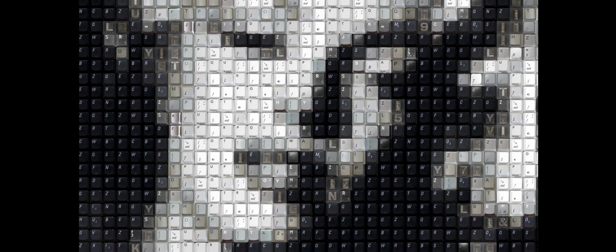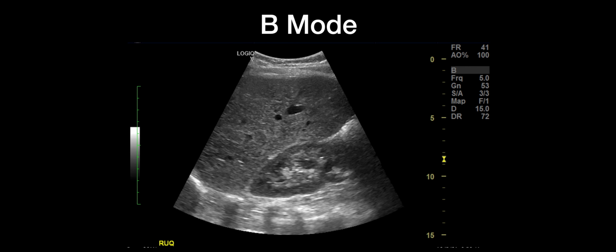in this circumstance. And as we get more and more information, like any pixelated image, something that is small amounts, when you get lots and lots of information, you get a readily apparent picture. And in the context of ultrasound, this is a picture of a right upper quadrant. And what we're seeing here is this is a kidney, this is your liver here, and this is the outside peritoneum with the spine towards the midline.